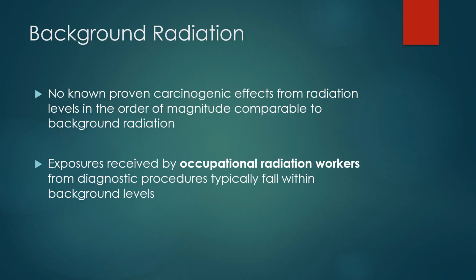There are no known proven carcinogenic effects from radiation levels in the order of magnitude comparable to background radiation. Typically, exposures received by the staff from diagnostic procedures fall well within background radiation levels.